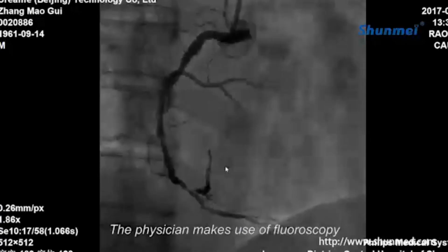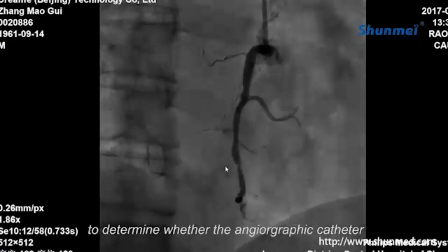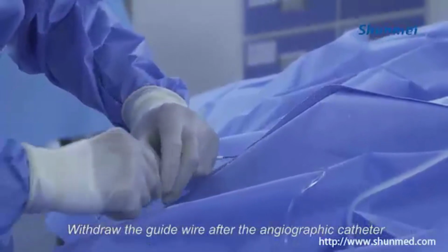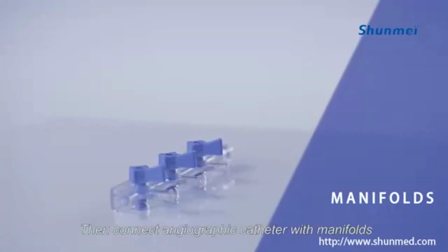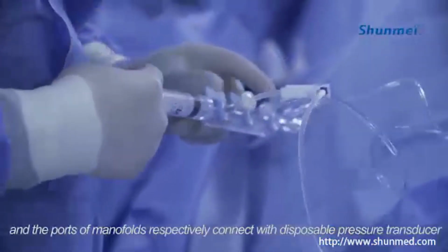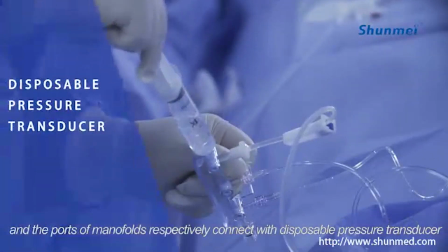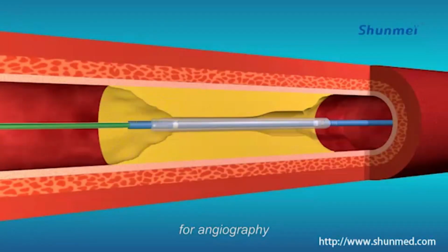The physician makes use of fluoroscopy to determine whether the angiographic catheter has reached the accurate place or not. Withdraw the guide wire after the angiographic catheter reaches the coronary artery. Then connect the angiographic catheter with manifolds, and the ports of the manifolds are respectively connected with a disposable pressure transducer, heparin saline for anticoagulation, and contrast media for angiography.